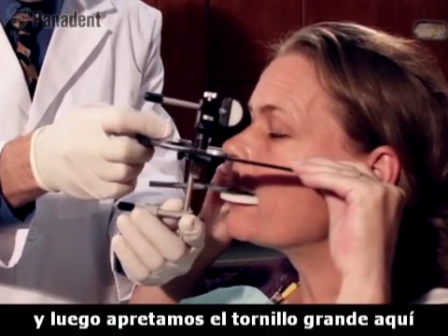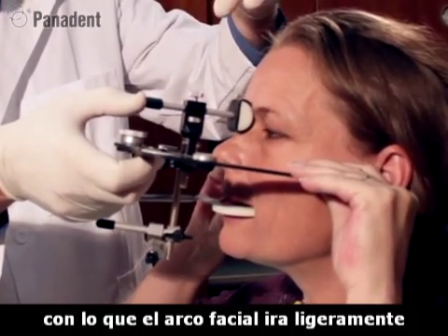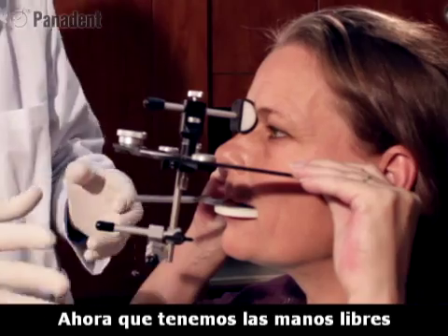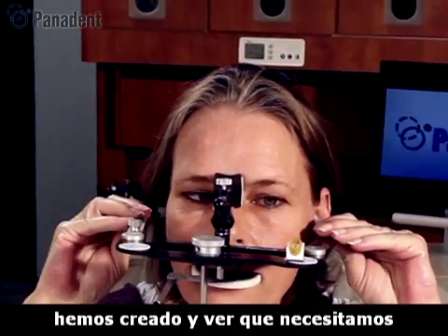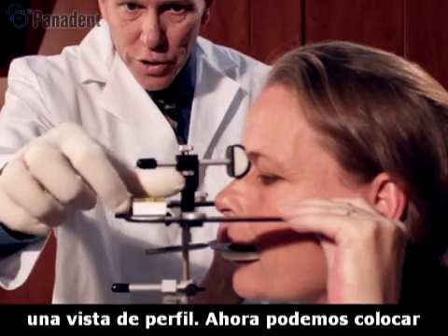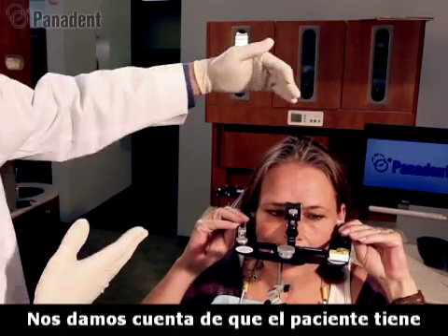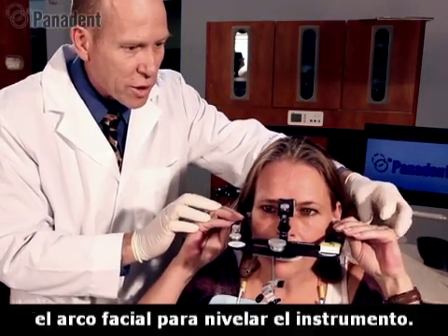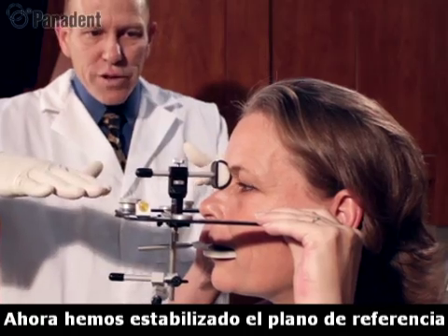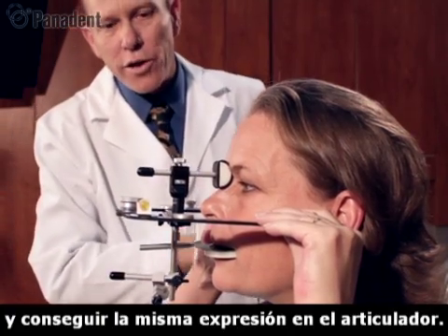I tighten the large screw here in the front, then raise or lower this until I can get the nasion related to the patient's nasion. I like to push slightly, bringing the face bow slightly forward in their ears — that helps stabilize the whole face bow. Now our hands are free and we can look at the level gauge to see that we need to level this down slightly until it's level from a profile view. We turn the level gauge in the frontal plane to check if it's level there as well. Some patients have one ear slightly higher, so we can have the patient move in the soft tissue of the ears slightly to level the gauge to the horizon. We've now leveled our planar reference to capture the transverse tilts of the occlusal plane as it looks in the patient's face, and get that same look on the articulator.